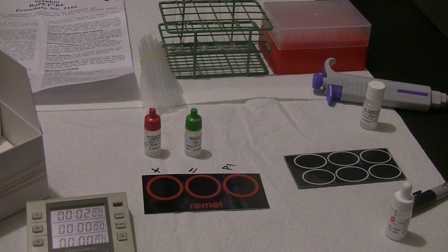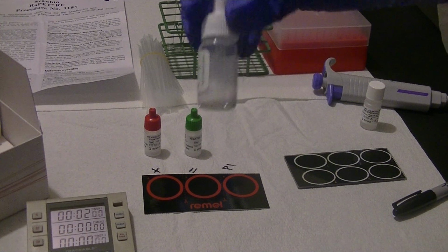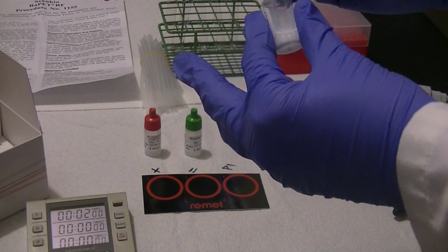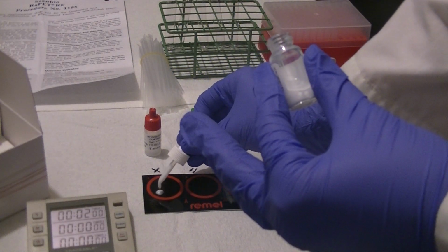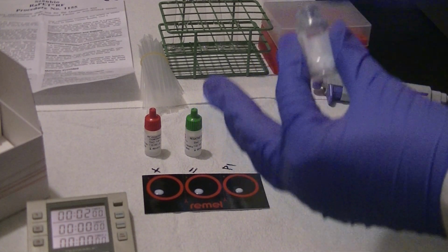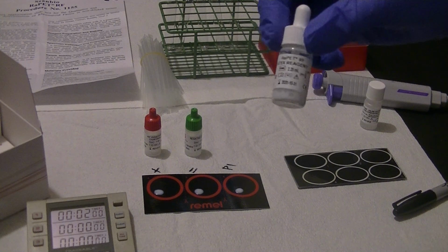So the first thing we're going to need to do is take a drop of latex reagent and place it in each of the reaction circles. So I have gently mixed the latex particles to dispense them, and there's a dropper included with this reagent vial. And I'm going to put my drop of latex reagent a little bit to the side of the circle. I'll tell you why in a moment. And one drop of any reagent from a dropper is approximately 40 microliters in size.